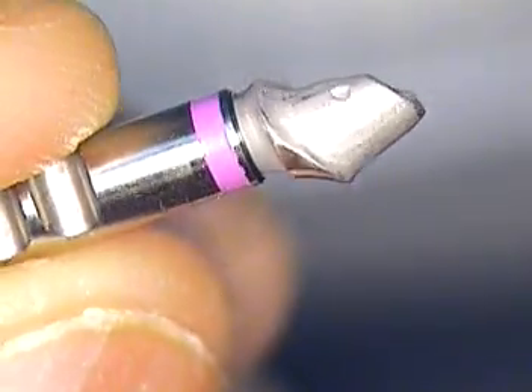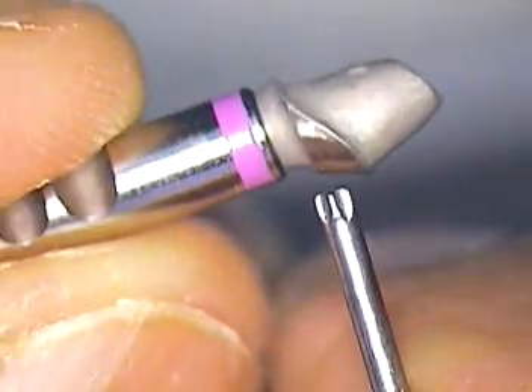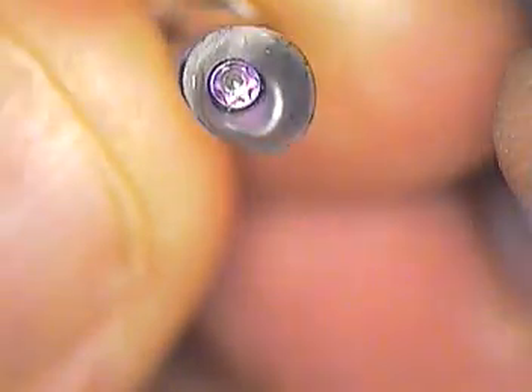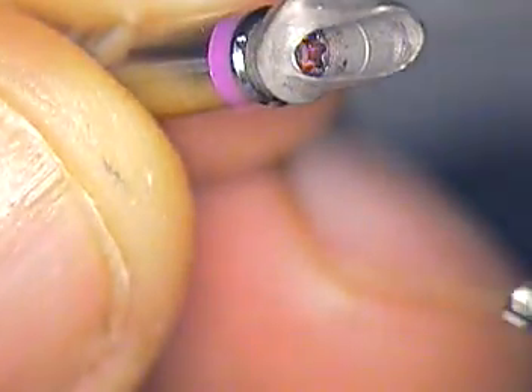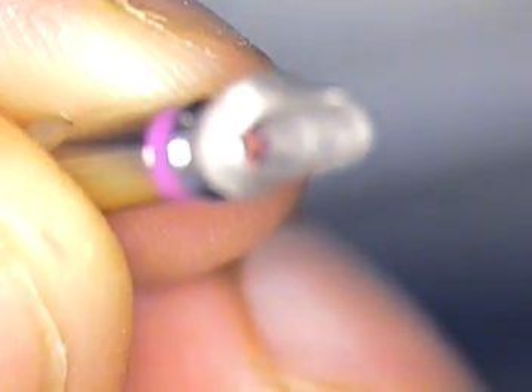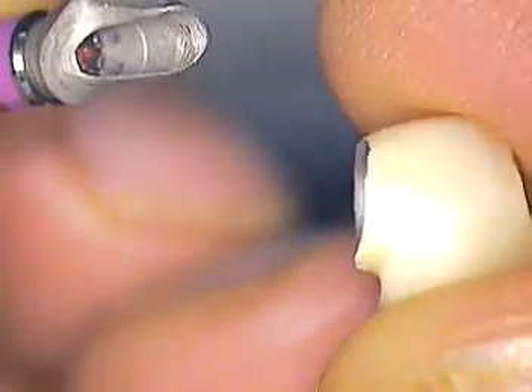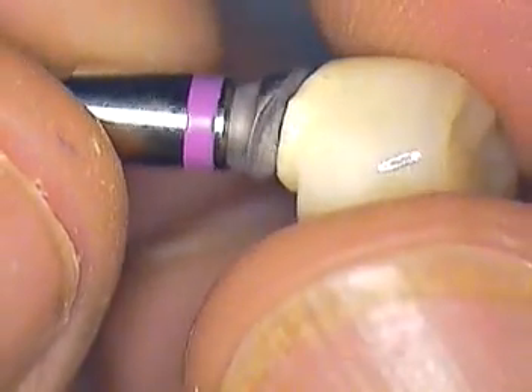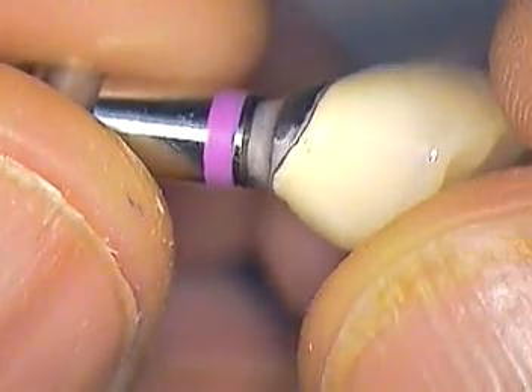This drew me for a loop. I normally don't see this from my lab and I don't know why that's there, so I'm going to ask him about it. That's what you get on this show — you'll get all the good cases, and you'll get some cases that need further modification. We're not afraid of showing you some of these cases that do need more work.